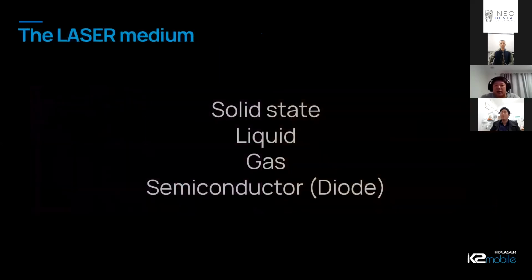There's many different types of lasers depending on what medium the laser is using. So the first question you have to ask yourself is what you actually want to achieve with using laser dentistry. Is it that you want to be able to cut hard tissue like enamel, dentin, or bone, or soft tissue, or both? And so today I'm talking about diode lasers, the semiconductors.